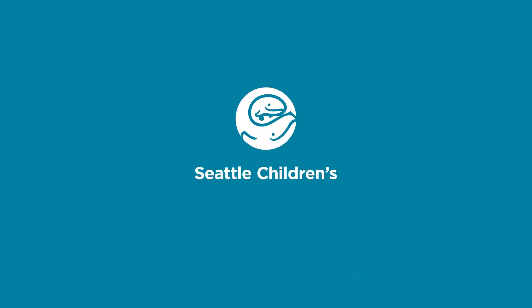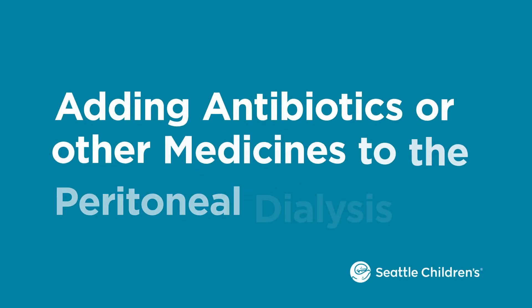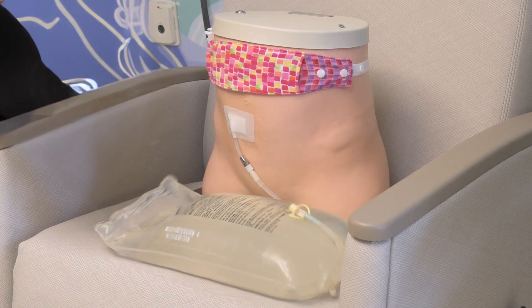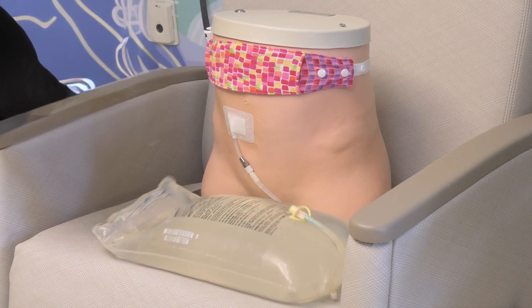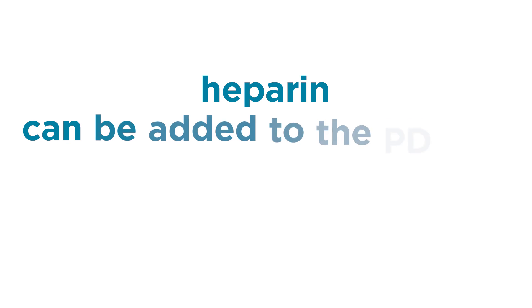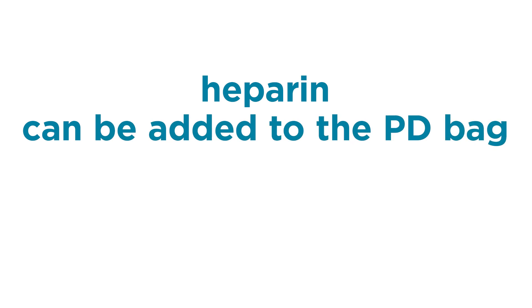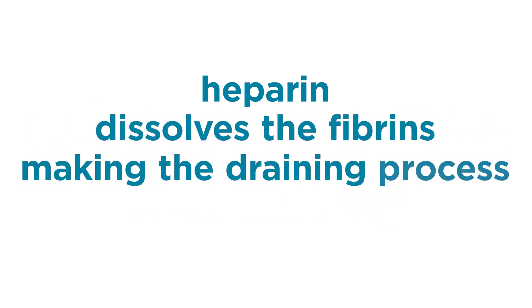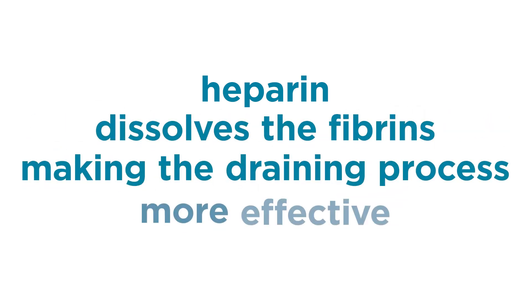This video shows how to add antibiotics to the PD solution bags. This is done when an infection in the belly area, called peritonitis, is suspected or confirmed. Other medicines such as heparin can also be added to the PD solution bag. Heparin is added when fibrin is present in the drain bag, as it dissolves the fibrin which makes the draining process more effective.